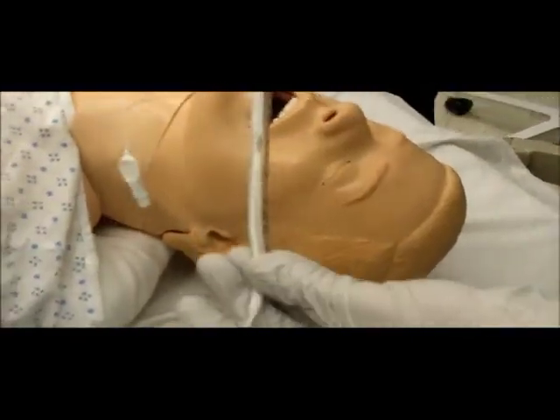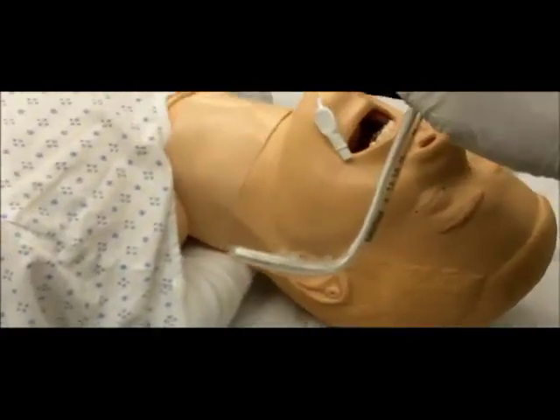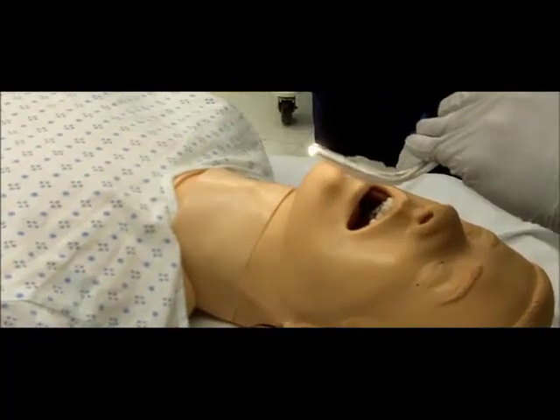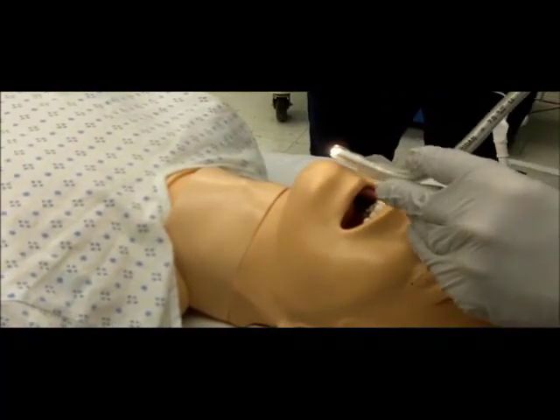Turn on the stylet light. The provider should position himself or herself at the head of the patient and have clear visualization of the anterior neck. Consider dimming the light in the room, as this will help visualize the light that is transmitted from the anterior larynx.